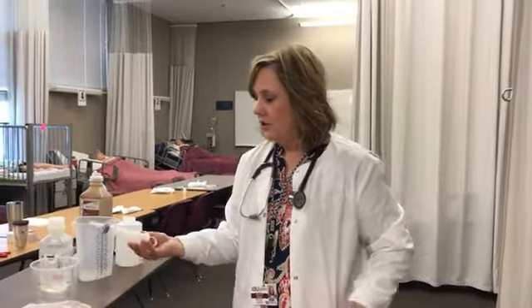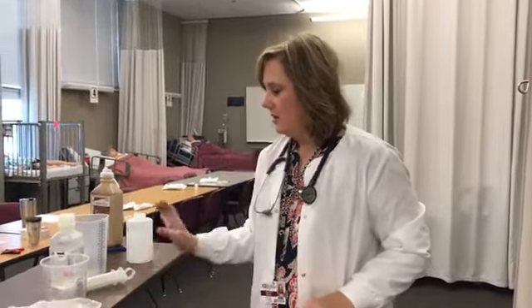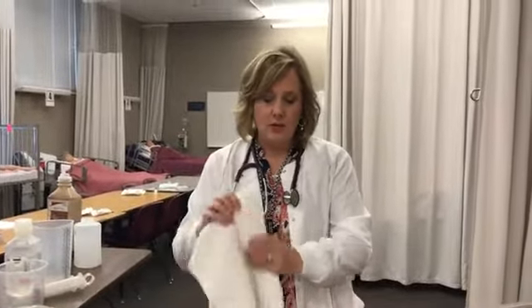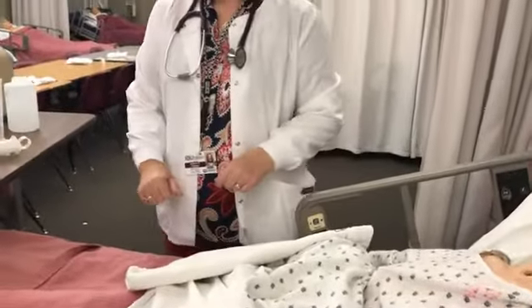It's a good idea to have all your supplies gathered before you go into the room. You'll need your syringe, your feeding, your water and some measurements, gloves, and it's also a good idea to use a towel as well, just to prevent getting the linen soiled.